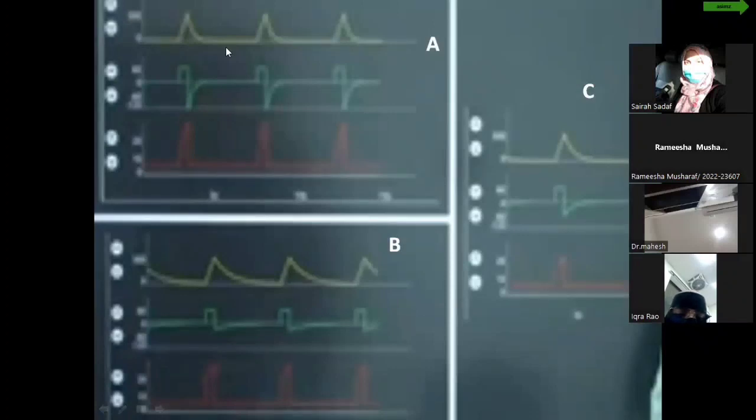Okay, everyone is saying C is normal. A is normal? No, Jennifer, A is not normal. C is normal. Okay. C is normal. B is spasm. Yeah, B is spasm. A is not obstruction, Pradeep, A is not obstruction. A is ARDS. Yes, A is ARDS. A is lung compliance. Good. Yes, very good. I'm happy that you all have learned this.